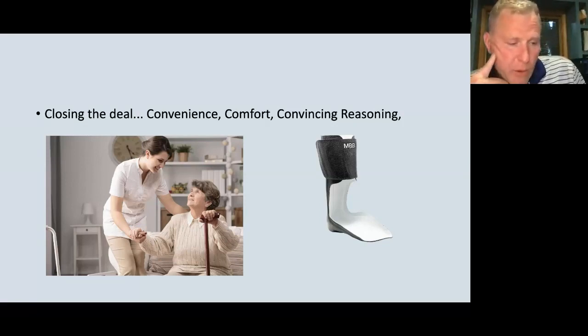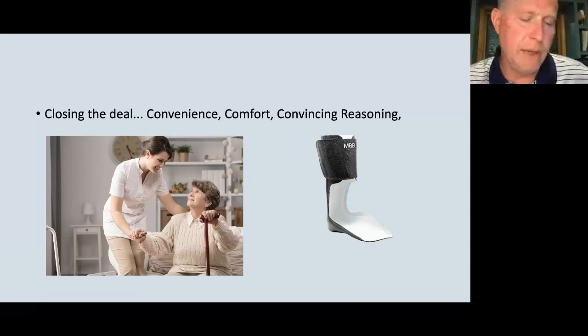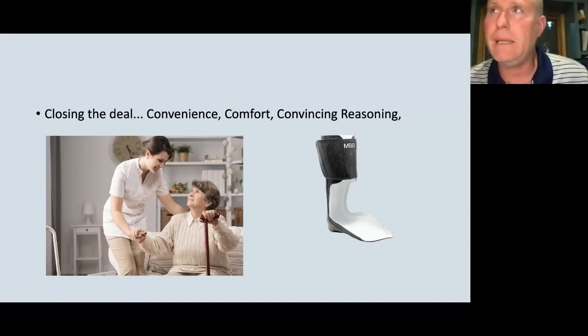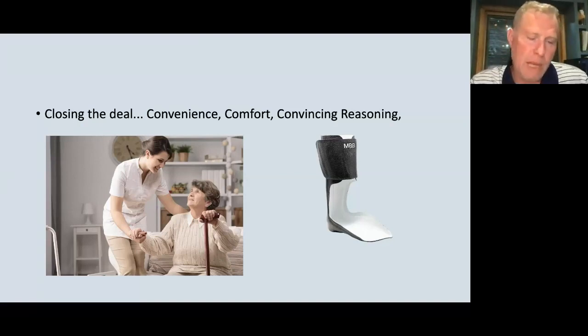In fact, I will tell you, over many, many years, I've had doctors come and say, I started using the brace, and the patients sometimes struggle with them. I'm not getting the best outcomes. And I'll ask them, the first thing I'll ask is, what shoe are you putting them in? They go, what do you mean, putting them in a shoe? I'm not putting them in any shoe. I'm just jamming it in what they come in with. And I'll just look at them and I'll say it will never work.